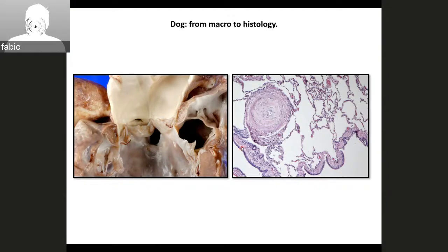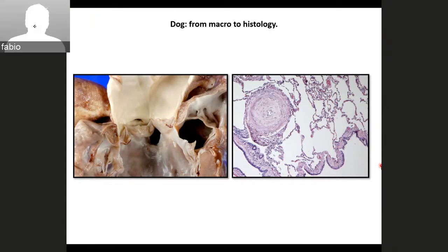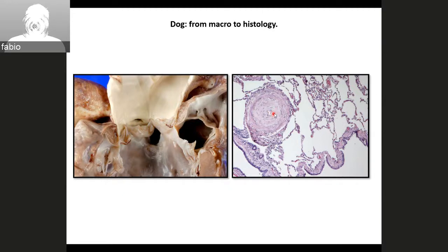Okay. Also here. But in the histo picture, what is the focus? Yeah, I think there is a rounded area. I can't really increase the size of this picture any more than this. But it looks like it's a rounded area with possibly a thick wall. In the middle, there is a small cavity. Yeah, there is a very small cavity.